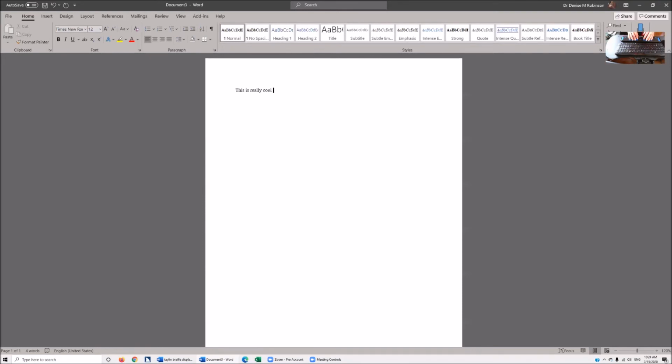That is your backspace. That's on the left-hand side. So I'm going to go ahead and do 6, 8 in space and then H. Upper ribbon, home tab. To switch pages, press Control Tab, Alt followed by H. And you can go ahead and right arrow through all of that. I'm just going to do .6 in space.